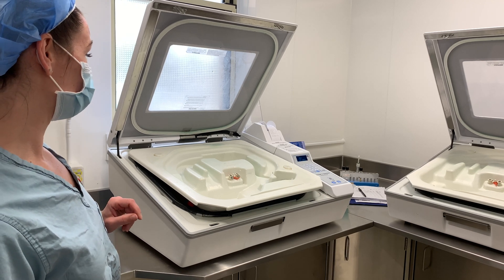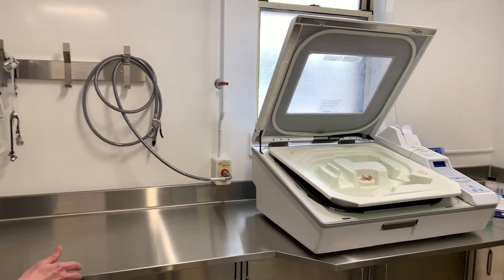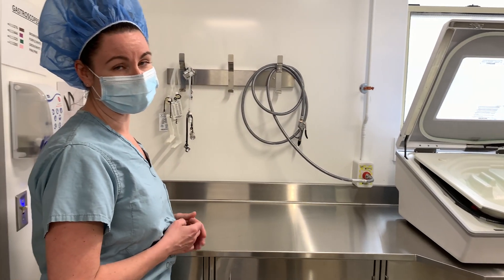After the cycle, the endoscope is taken out, it's flushed with alcohol, and then it is blown dry with forced air.